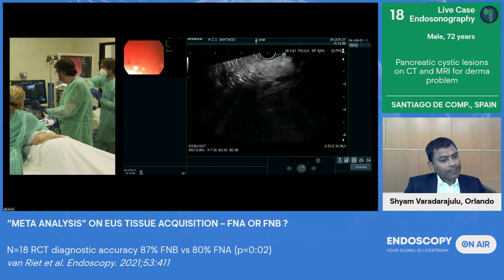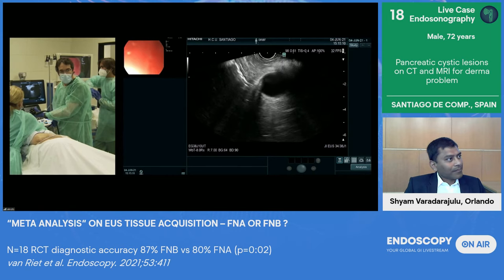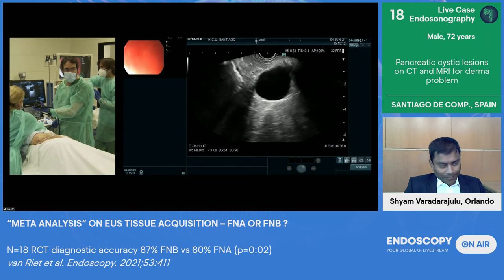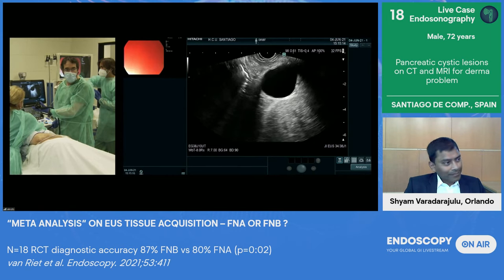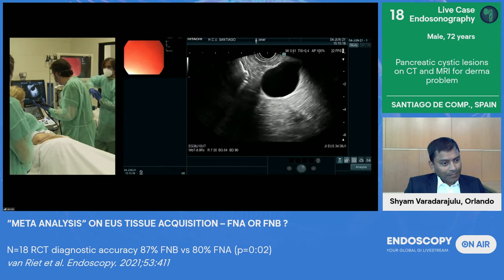So I'm just coming back again, and here we have again the cystic lesion. You can very nicely see the big lesion that is probably the one that we need to target to try FNA, and we will attempt to do a micro forceps biopsy.